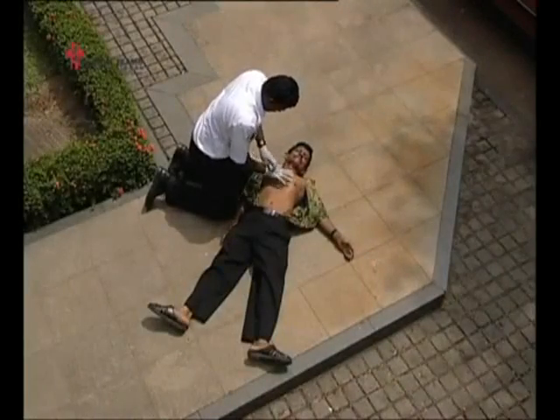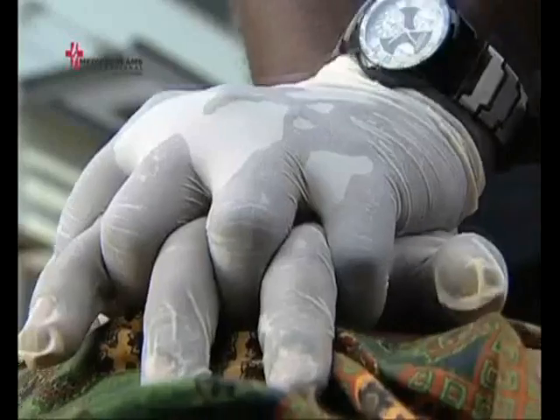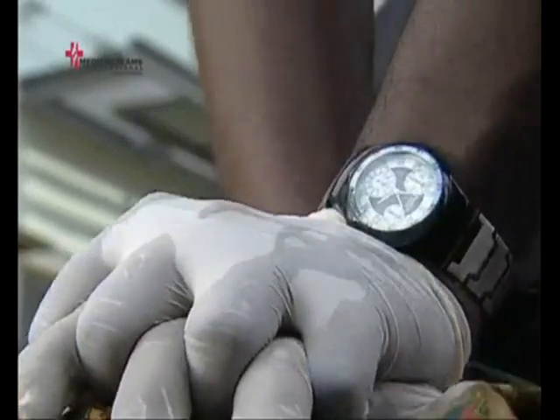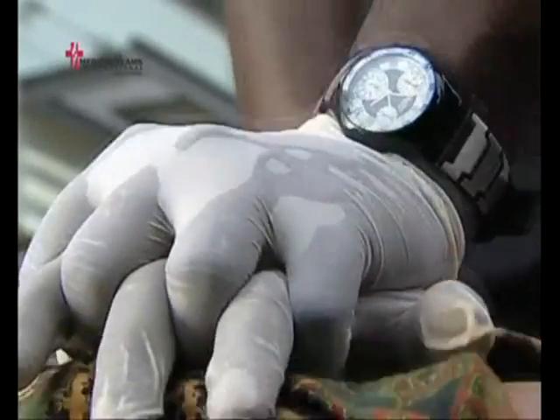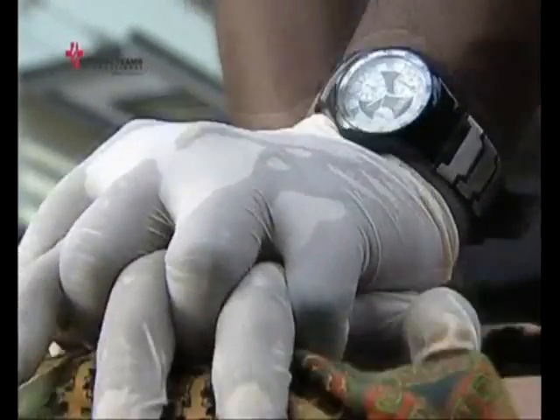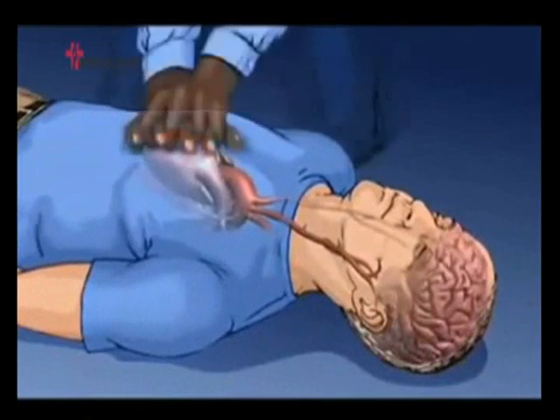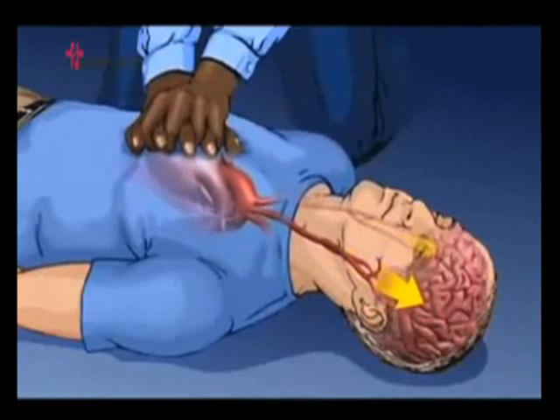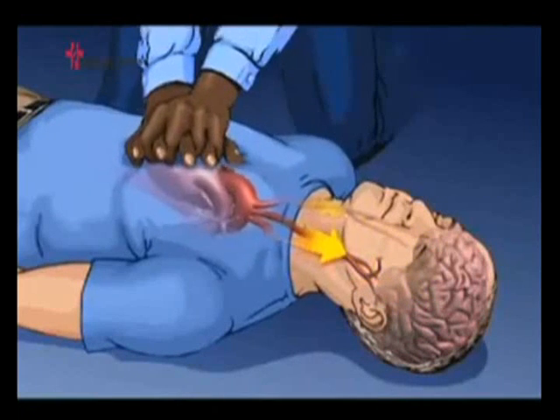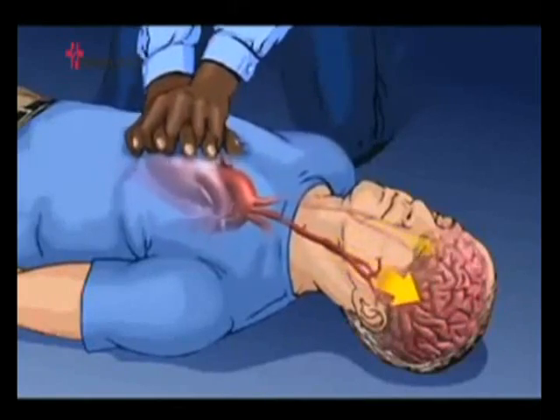Cardiopulmonary resuscitation, or CPR, is an emergency life-saving procedure that is performed when a person stops breathing and the heartbeat has stopped. This is known as cardiac arrest. CPR combines rescue breathing with chest compressions. The purpose of CPR is to keep oxygenated blood circulating to the patient's brain and heart until a cardiac rhythm has been restored and the patient has a pulse again. Permanent brain damage or death can occur within minutes if blood flow stops.